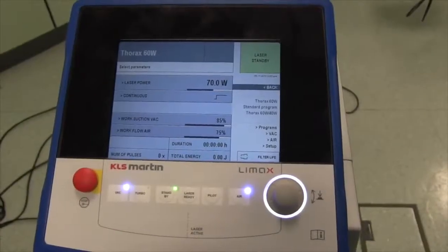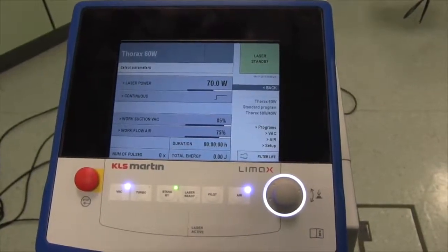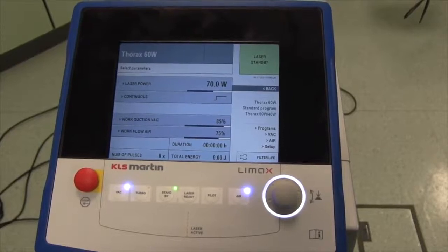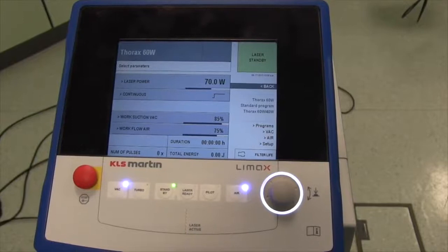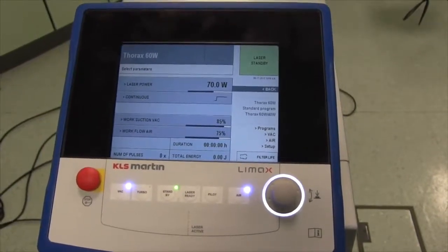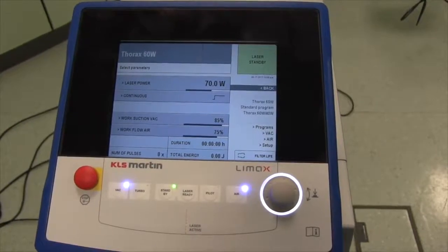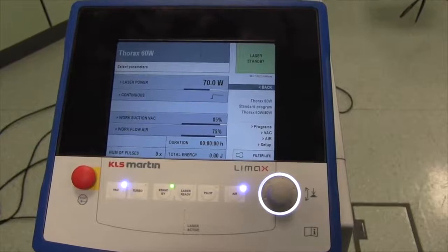Now two parameter settings are connected via swap mode. The surgeon benefits from the swap mode since he is able to switch between two parameter settings from the sterile area by pressing the foot switch. The current program is meant to be Program A.